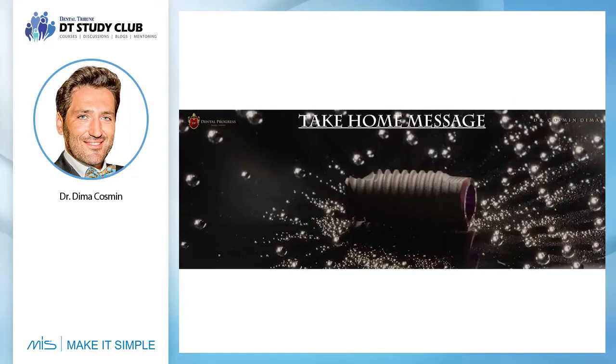So it's time for take-home message. For intralift, it is very important to have proper irrigation, otherwise you can provoke some problems to the bone. If the saline solution is not in contact every second with the bone, you can provoke necrosis.